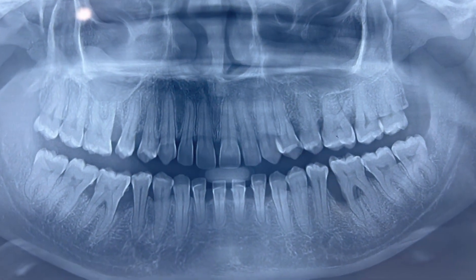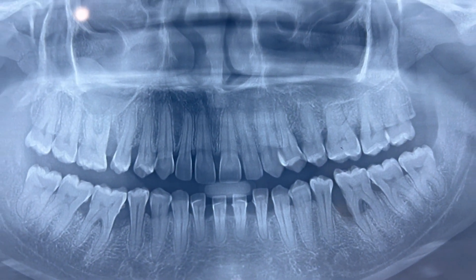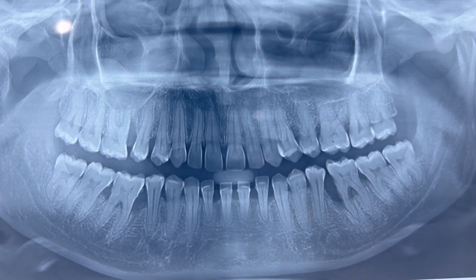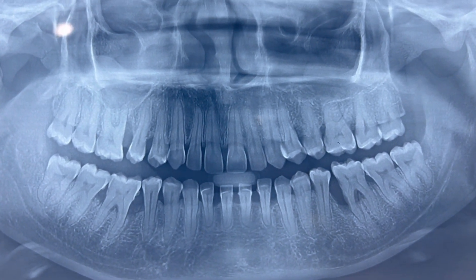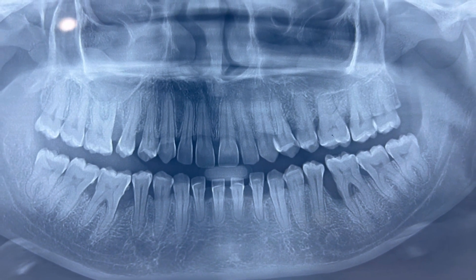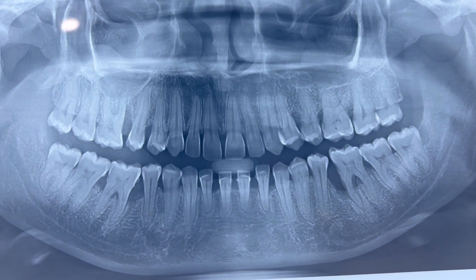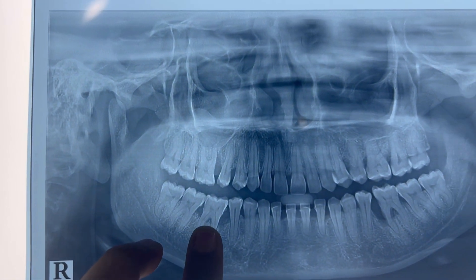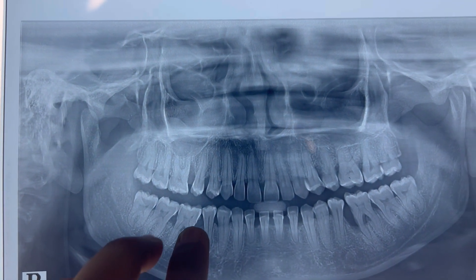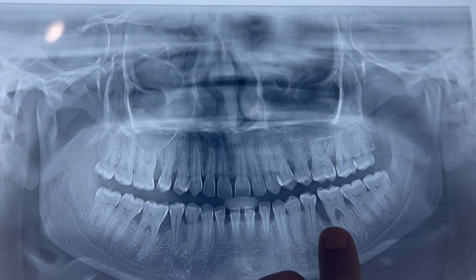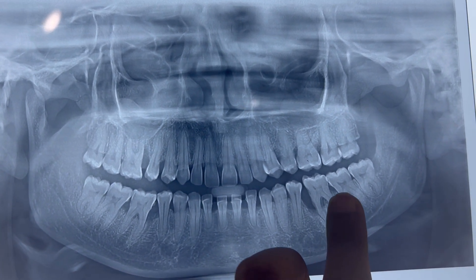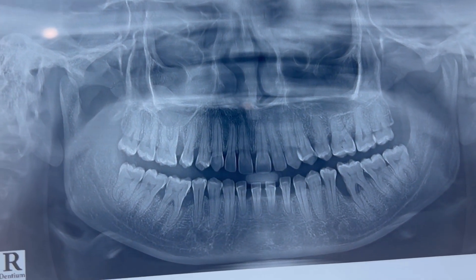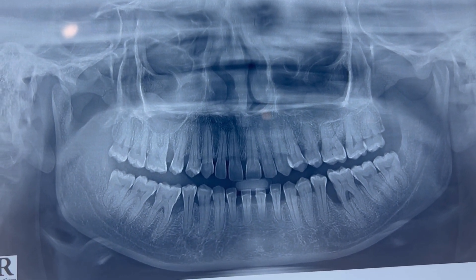A patient came to the Department of Periodontics in Noble Medical College with chief complaints of swelling of gums, bleeding gums, and tooth sensitivity. On examination, we found on the X-ray that there are multiple areas of bone loss. The patient is a young patient.